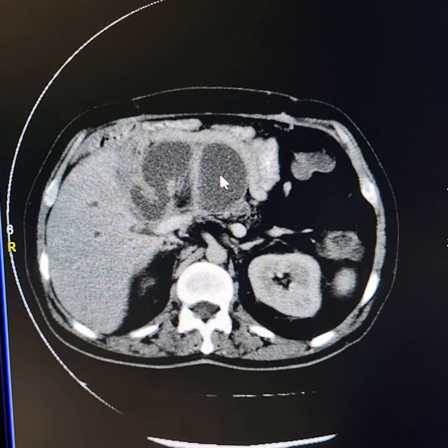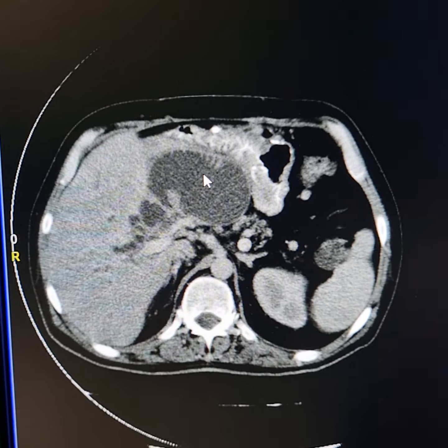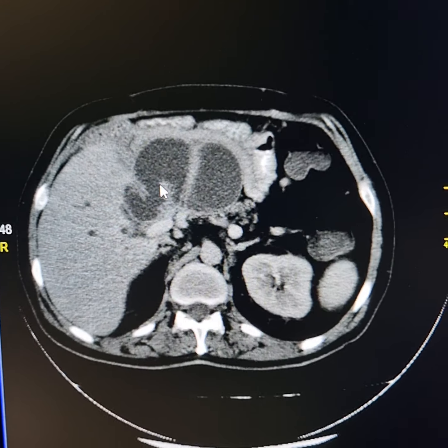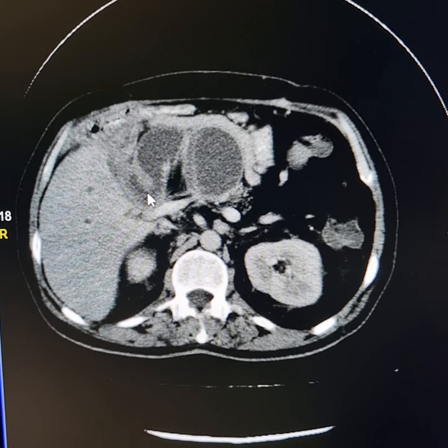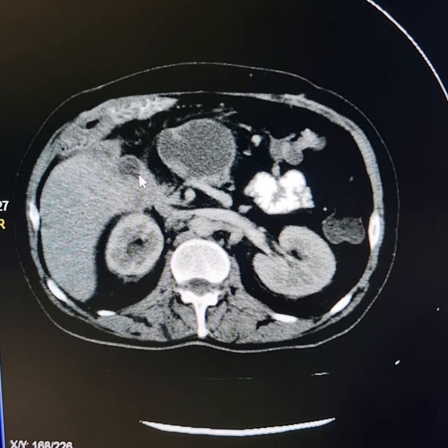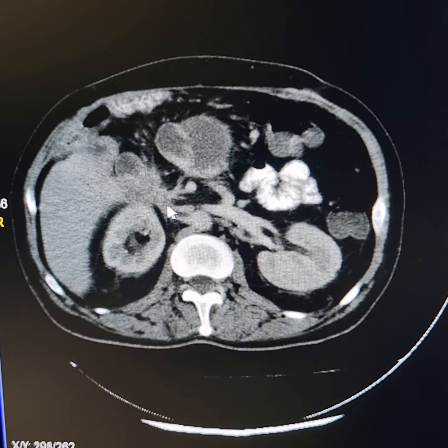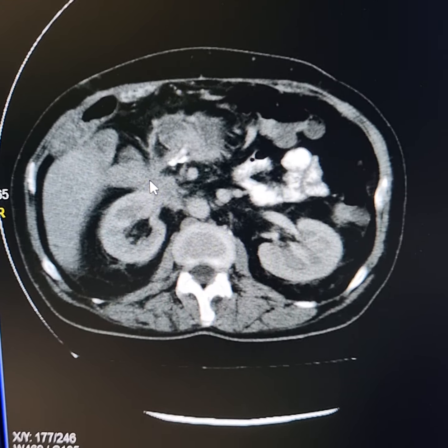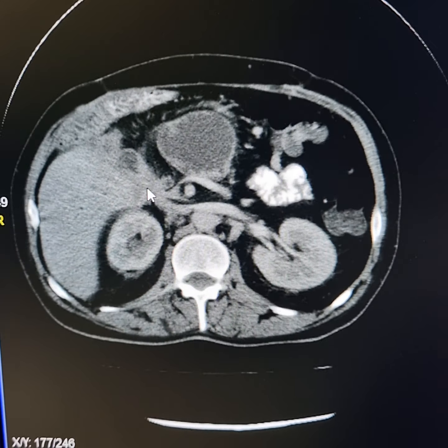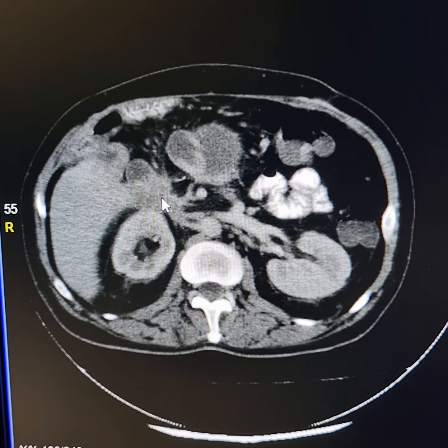Now this is the blind-ending, dilated, obstructed small gut segment. Please see these valvulae conniventes. Now I trace it down. Please follow this. This one is the mass lesion here. This is a metastatic mass lesion which has obstructed the afferent limb of jejunum.